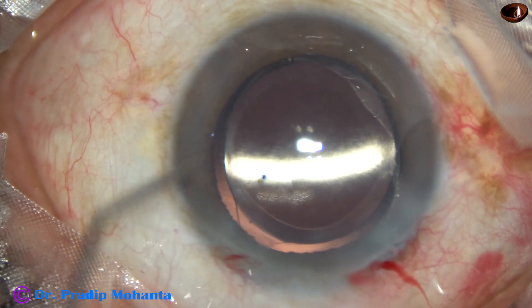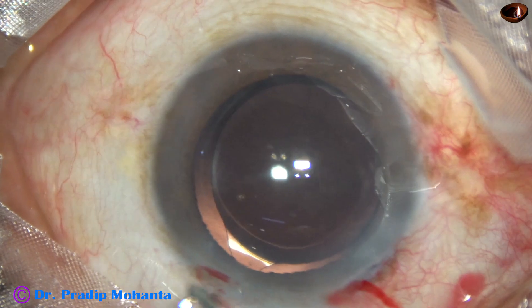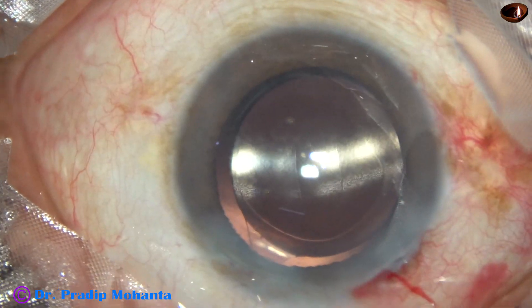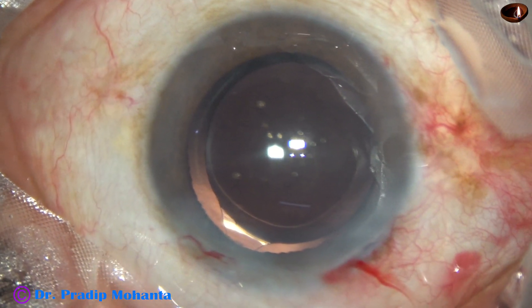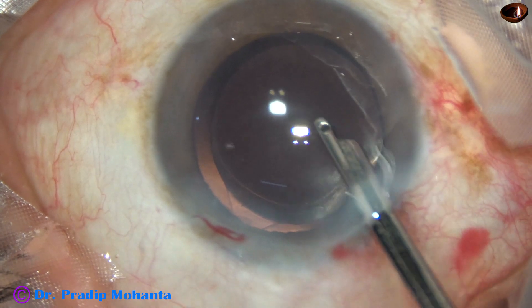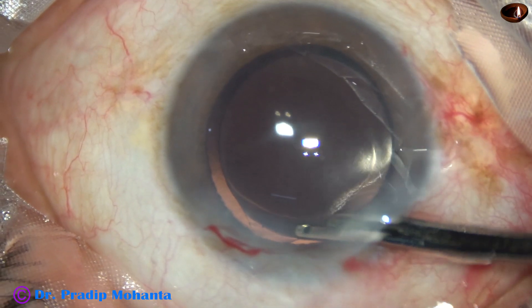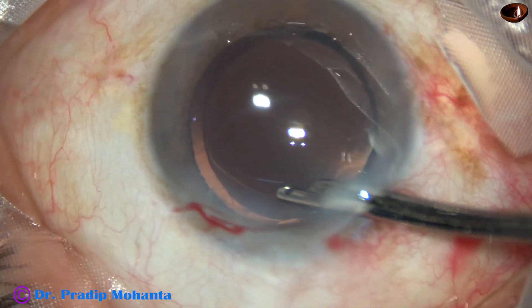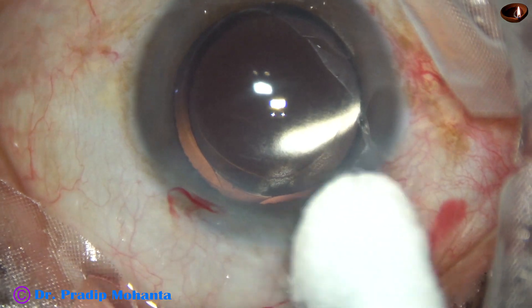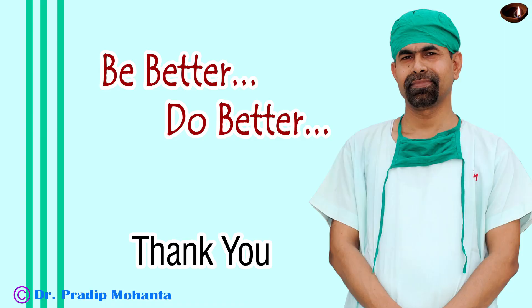Now a bit of moxifloxacin is applied. The side ports are hydrated nicely with BSS and closed. The other side port is also closed as it was not used much. This is the final lavage of the anterior chamber — the anterior chamber is formed very nicely. The integrity of the wounds is checked with a cotton-tipped applicator. A few drops of moxifloxacin are applied, and the case is concluded.